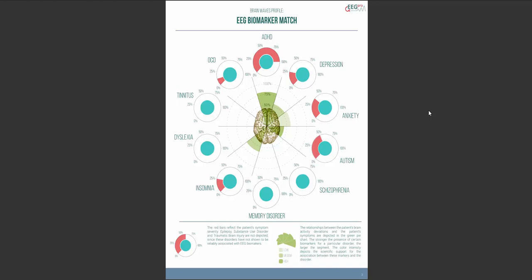The transparency of the green color conveys the scientific support of the EEG biomarkers that have been found for the disorder in question. When the green color is more transparent, the scientific support is relatively low. This is the case for the EEG biomarkers that have been found for anxiety in this example. There's an EEG biomarker match of more than 50%, but the transparency of the green color signals that the scientific support for the EEG biomarkers that have been found is relatively weak, which means that you should interpret this match with caution.